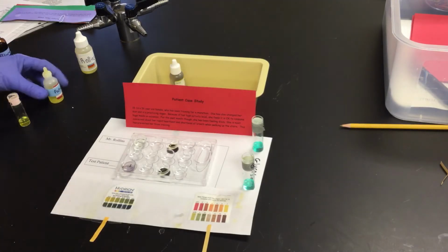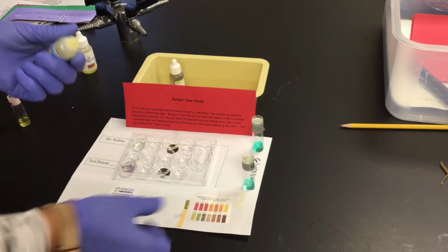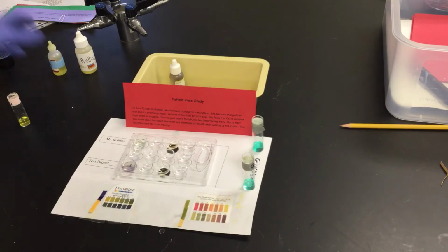So I'm going to take patient number 18. I'm going to take some of the urine from her, put it onto our pH paper and lay it next to our little scale so that you can measure it in a moment. And I'm going to do our second type of pH paper, which is a little more exact and goes 5.5 to 8. So I'm going to go down and zoom in for you.